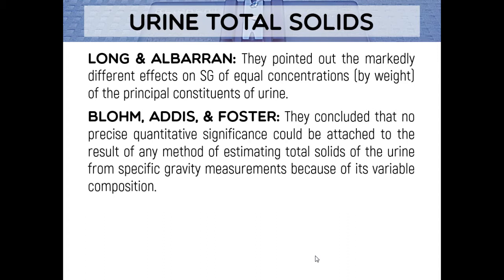Okay, so muna ilang na conclusion or na conclude. You cannot find a precise quantitative significance, bahalag unsa na method imong gamiton, to estimate solids from or by from SG or from specific gravity, because again of the variable composition na naa sa ihi. So muna lang mga na-find out.